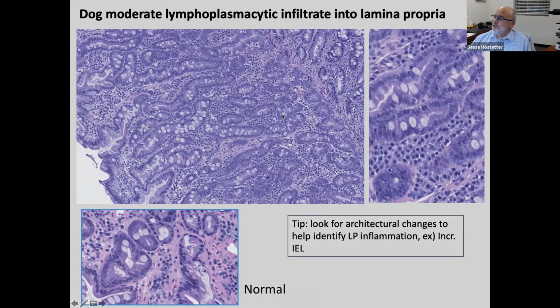If you look at this inflamed duodenum, and we scoot up to a higher magnification, you can see that the crypts are pushed apart by maybe 6 or 7 layers of lymphocytes and plasma cells. If we were to go up to the lamina propria and go down to a 40x field, maybe 50% of the field is taken up by plasma cells and lymphocytes.